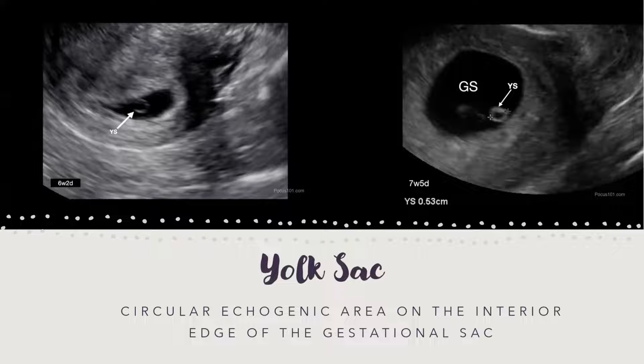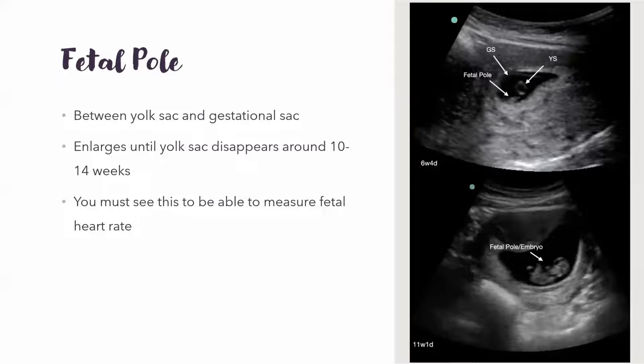The yolk sac is within the gestational sac — it's basically a hyperechoic little ring. It still has fluid on the inside, so it's dark and anechoic on the inside. The fetal pole grows between the yolk sac and the wall of the gestational sac, and this is what actually turns into the baby.